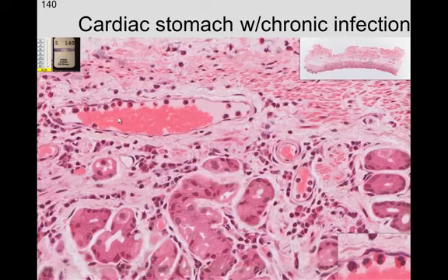And here we can see a blood vessel, and in the blood vessel you see a lot of cells that are marginating. That is, they are attached to the surface of the membrane of this little venule, and they are going to migrate out into this region where there is a chronic infection.